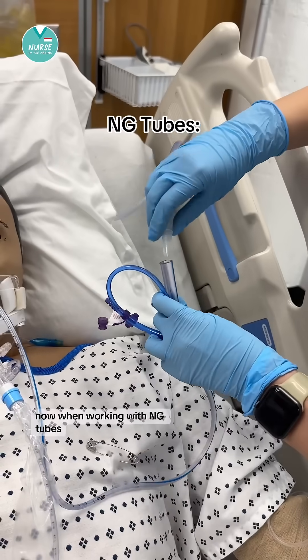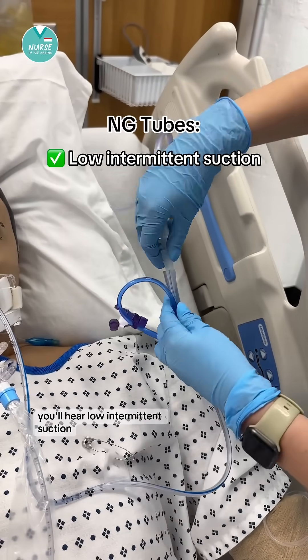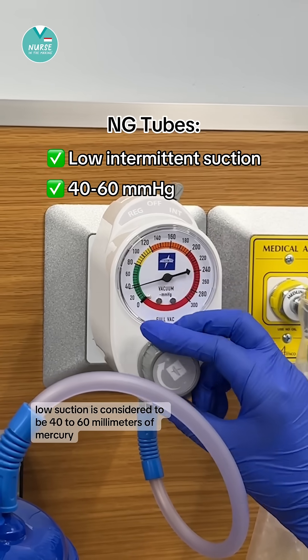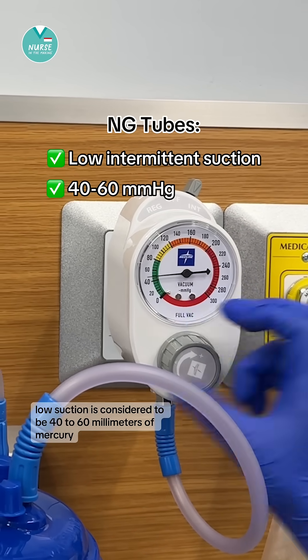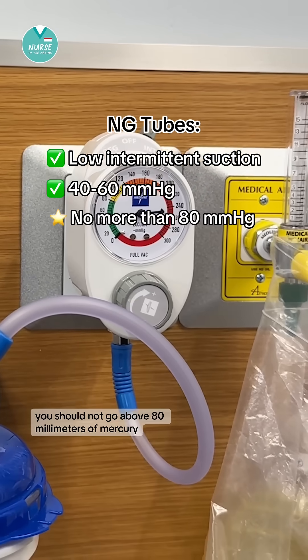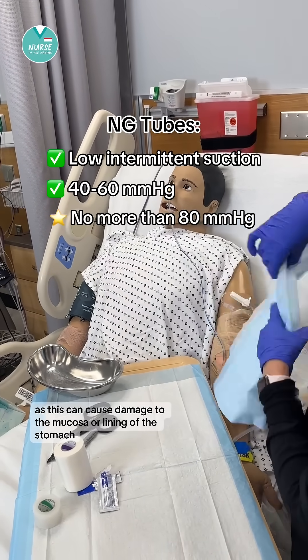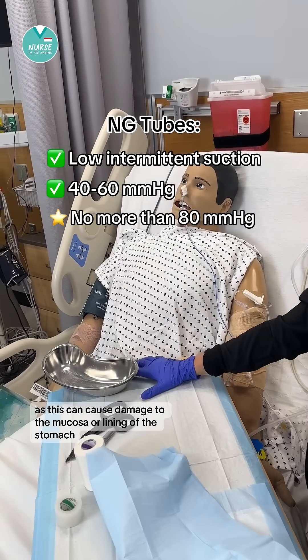Now when working with NG tubes, you'll hear the term low intermittent suction. Low suction is considered to be 40 to 60 millimeters of mercury. You should not go above 80 millimeters of mercury, as this can cause damage to the mucosa or lining of the stomach.